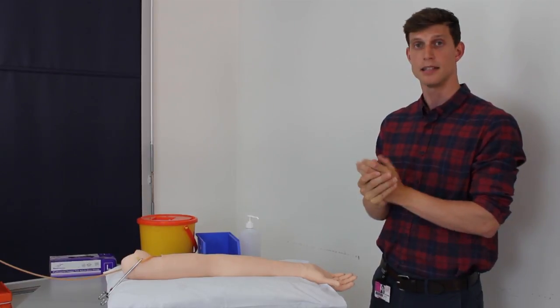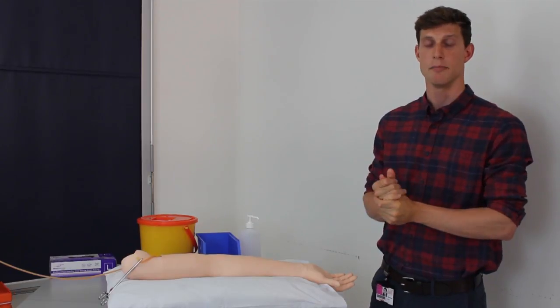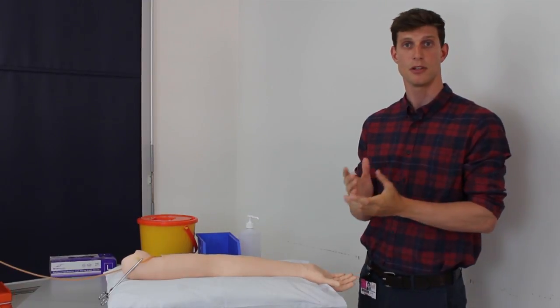What that means is placing a small needle into one of the arteries in the wrist. It may cause a little discomfort but shouldn't be too painful. If it is too painful then please let me know and we'll stop.